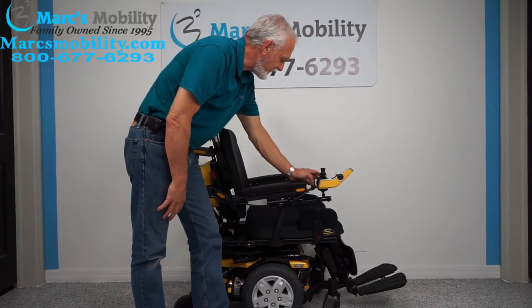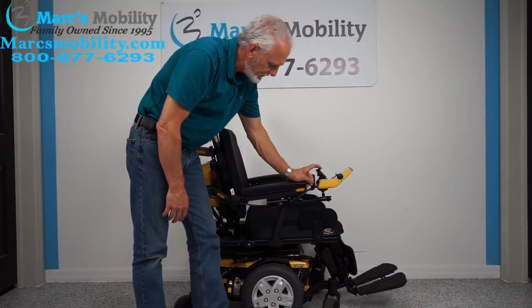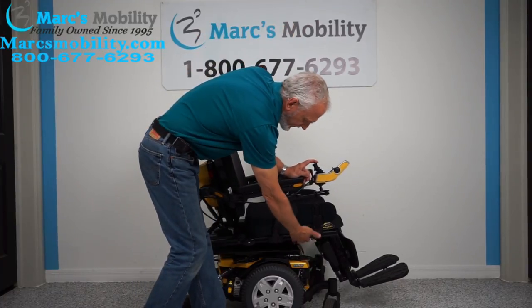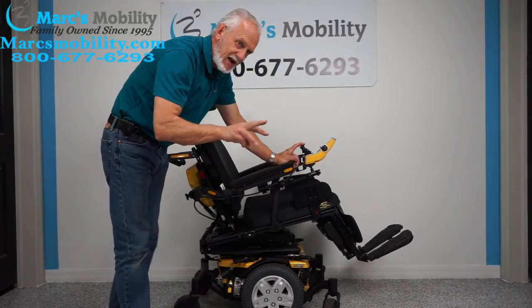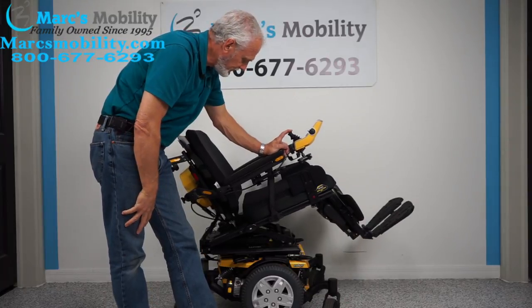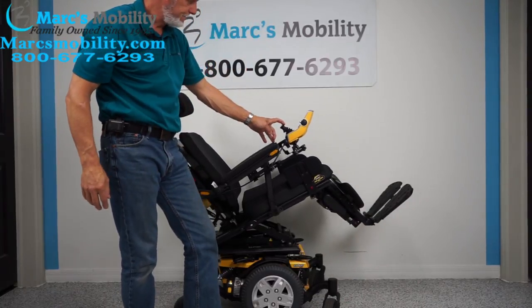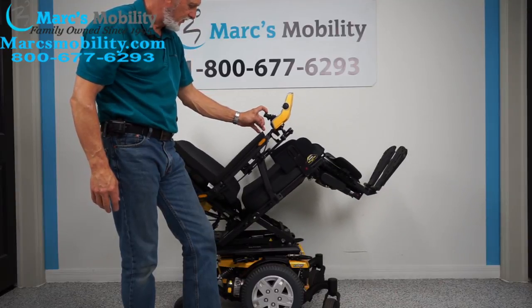The second option is the tilt. The tilt is when the base goes back — it takes the legs and the back because they're all connected together. That's called the electric tilt. We'll see how far this goes — it's a full tilt.